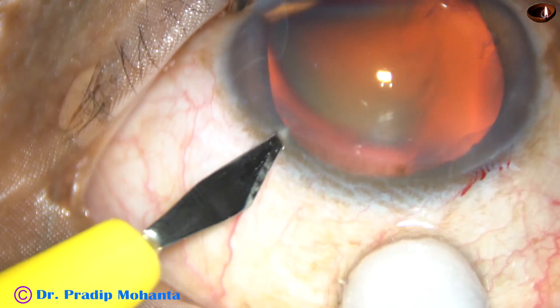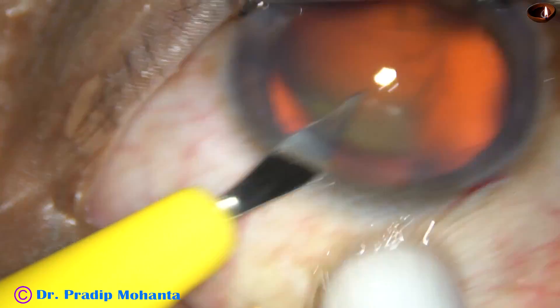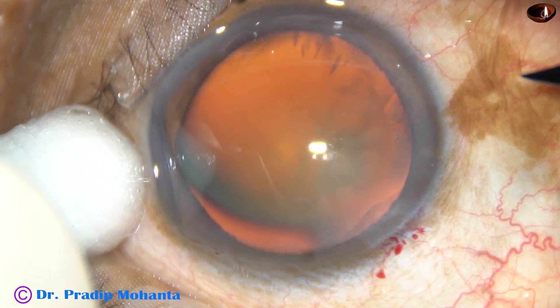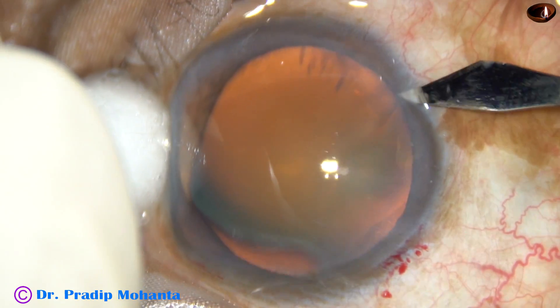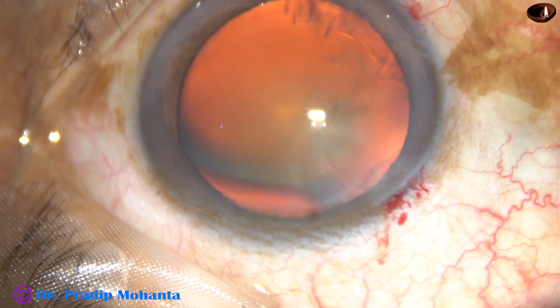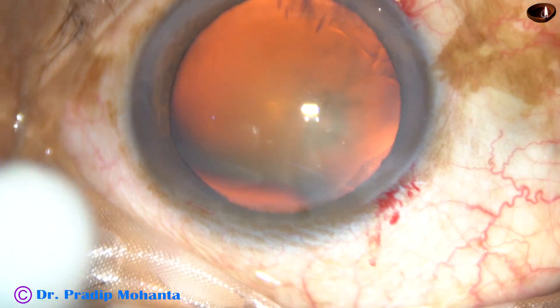This is a paracentesis on the left side of the main incision, about 2.5 clock hours away. And this is another paracentesis on the right side of the main incision, about 3 clock hours away.